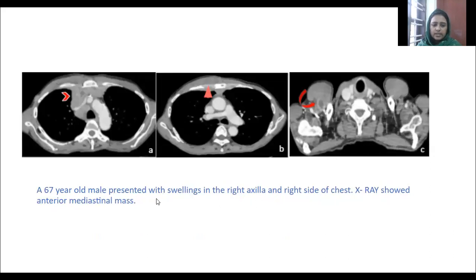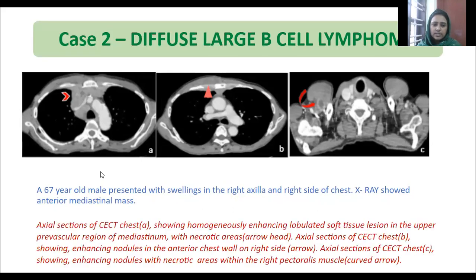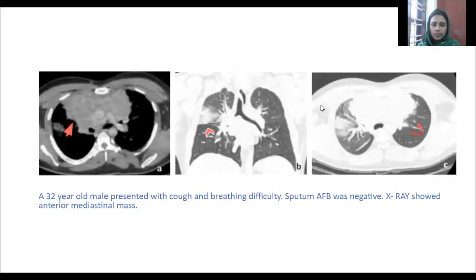In the next case, a 67-year-old male presented with swelling in the right axilla and right side of his chest. X-ray showed an anterior mediastinal mass. CT chest showing homogeneously enhancing lobulated soft tissue lesion in the upper pre-vascular region of the mediastinum with necrotic areas. Axial CT chest images showing enhancing nodules in the anterior chest wall on the right side, as well as in the right pectoralis major with a few necrotic areas. Biopsy revealed large B-cell lymphoma.